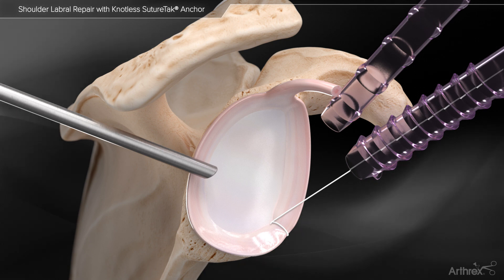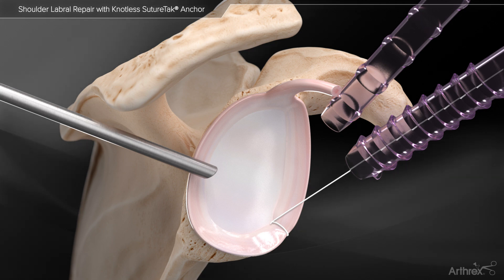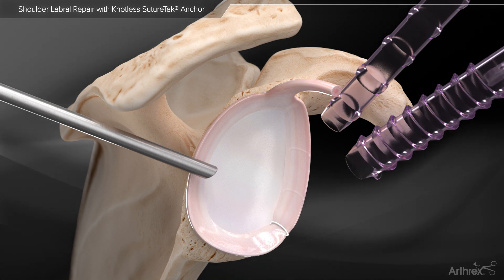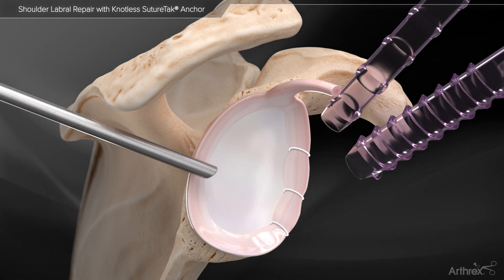The repair suture can be controlled and tensioned under direct visualization until the desired tension is achieved. The mini suture cutter has a small tip design that fits into the anchor hole and cuts the suture flush, leaving a secure, low-profile knotless repair.